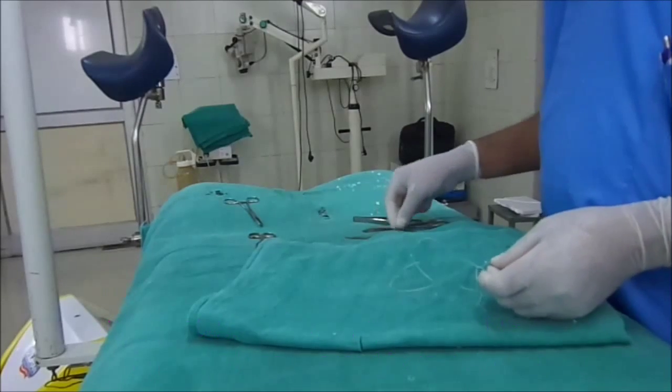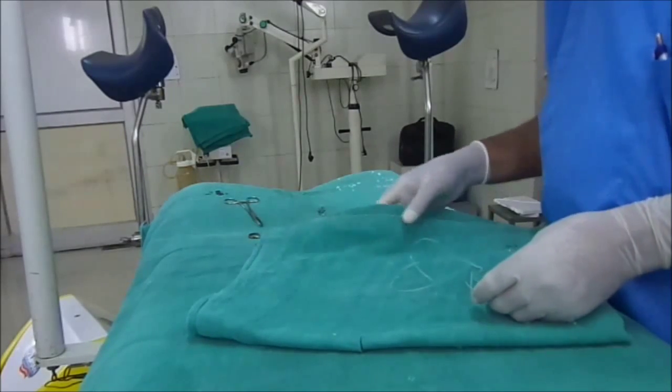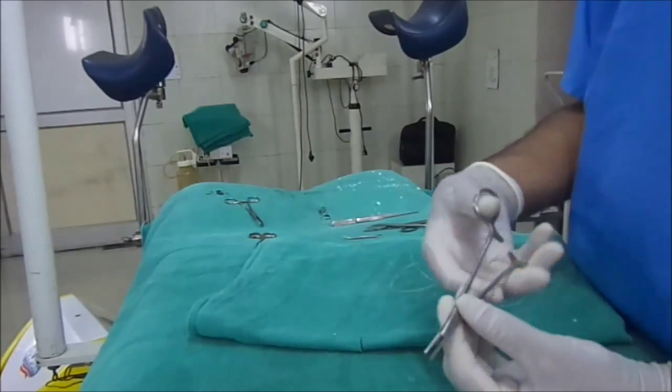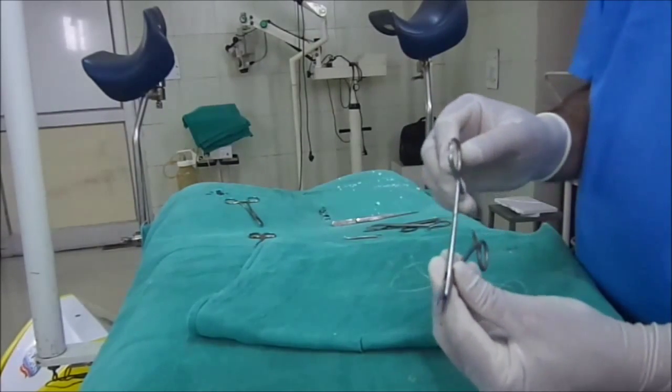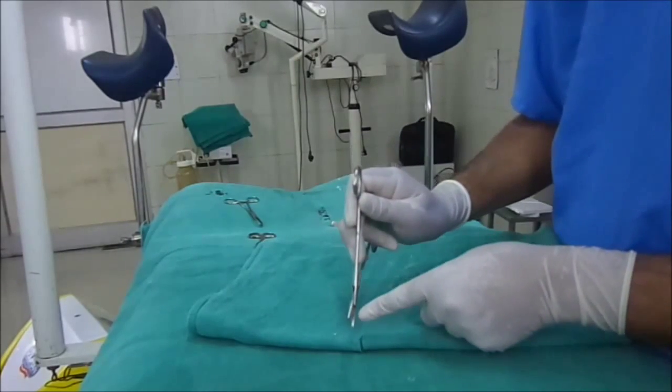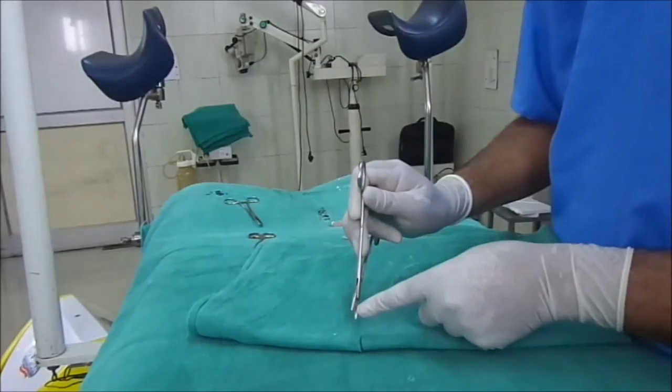The second instrument is the needle holder. The needle holder is just like a hemostat, but it contains a furrow — it contains a furrow over here.